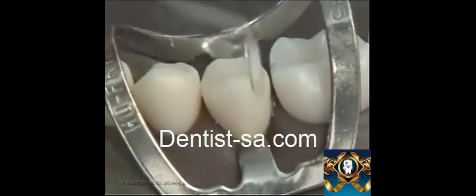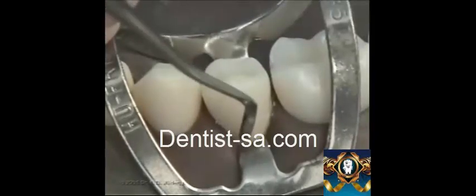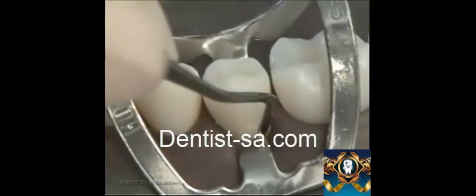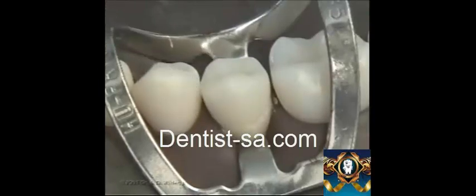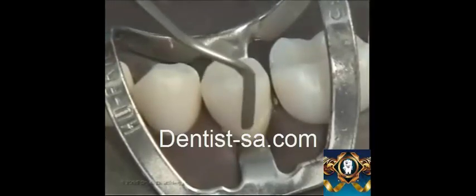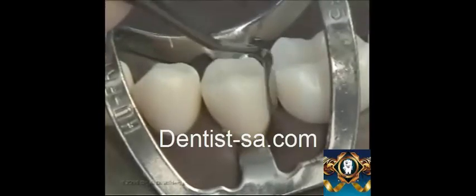Composite is now being adapted over the cavo-surface margin so that there is no excess or any deficiency in the cavo-surface margin region. Contouring is done in a very diligent manner to minimize the finishing procedure later. Slowly it is adapted.